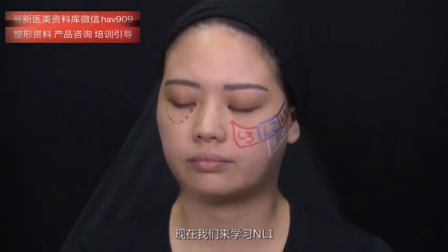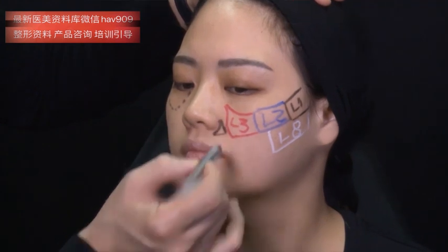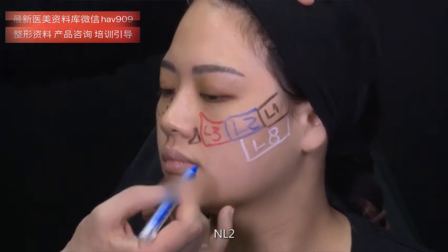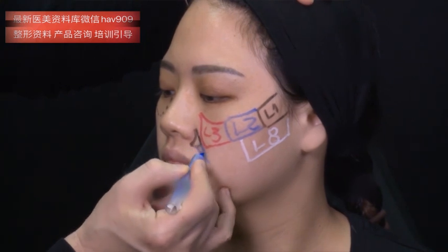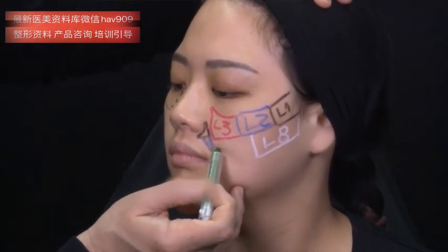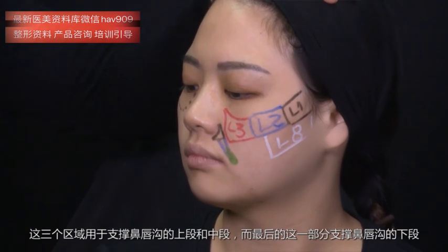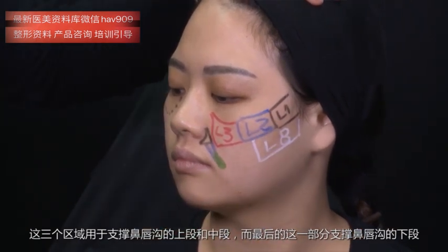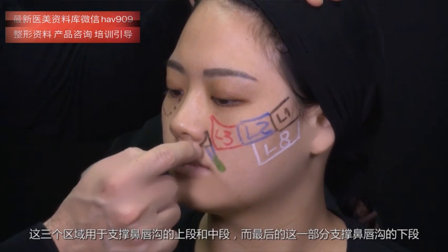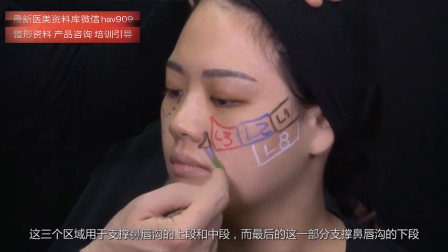Now, let's study NL1, and NL2, and NL3. So, 3 areas to support the upper part and mid part of the nasolabial fold, and one last part to give support to the lower part.